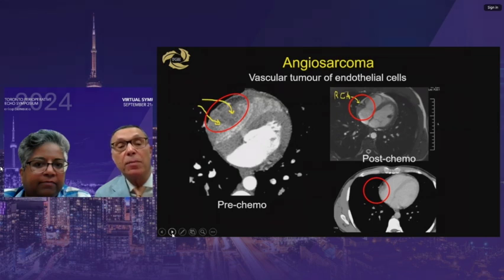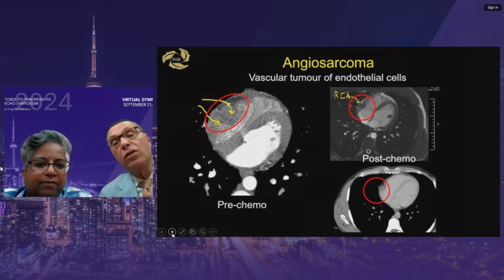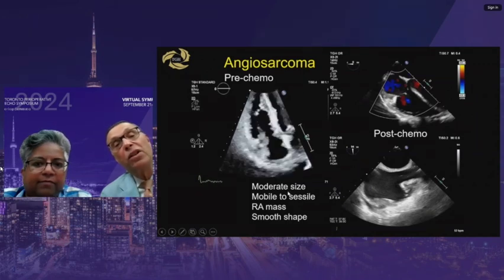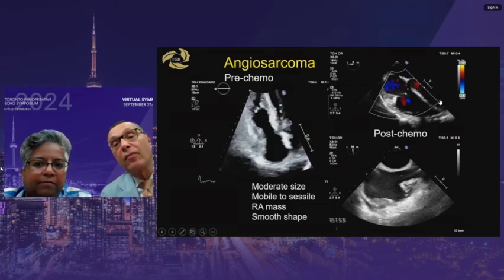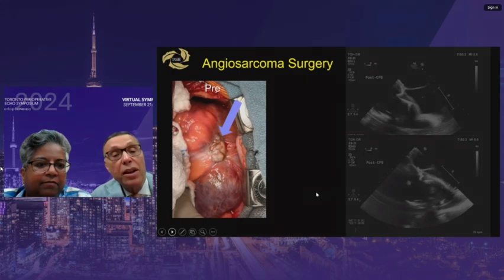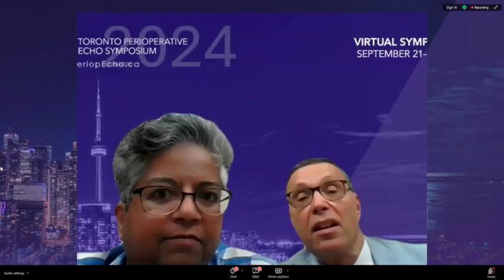An angiosarcoma case: the approach is biopsy first, then chemotherapy, and you can see how dramatically the tumor has shrunk. However, even after shrinkage it involves the AV groove and the right coronary artery will need to go — making this a major resection despite the smaller appearance. A sarcoma can look just like a myxoma or fibroelastoma except for its abnormal location. After chemotherapy, the tumor changes its appearance. The resection required complete removal of the SVC, IVC, right atrium, tricuspid valve, and coronary artery. Post-operatively the right atrium is reconstructed with pericardium, creating significant artifacts on echo.